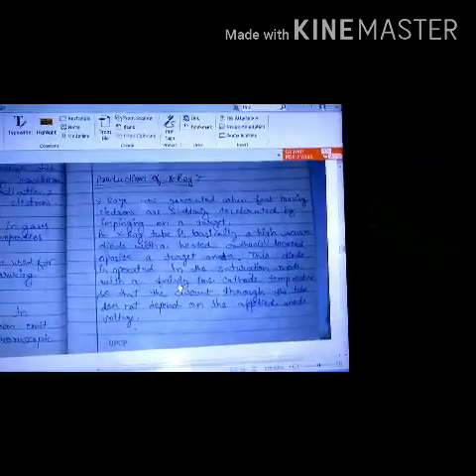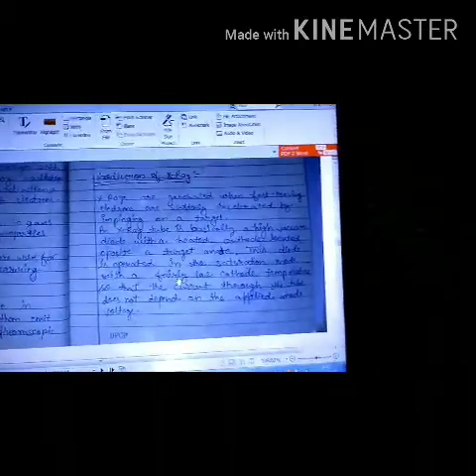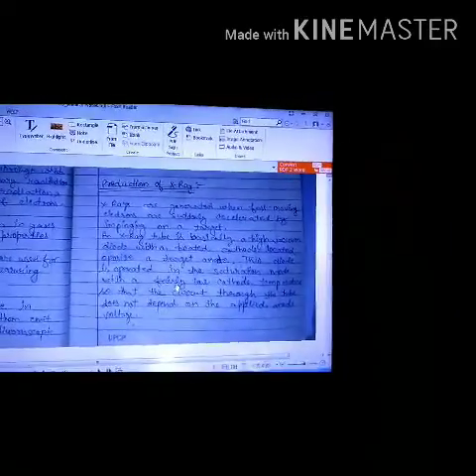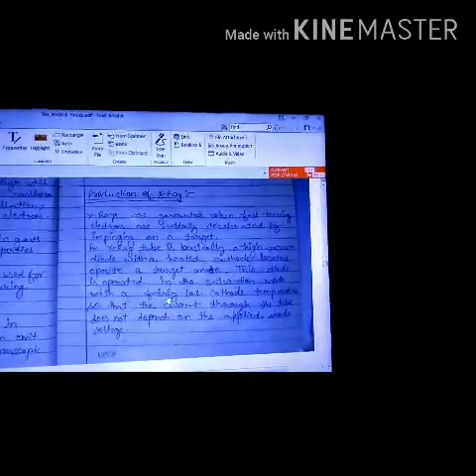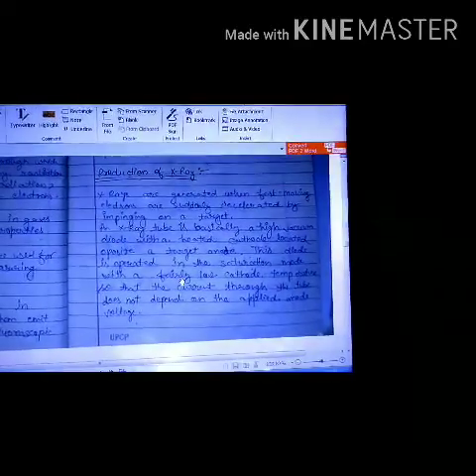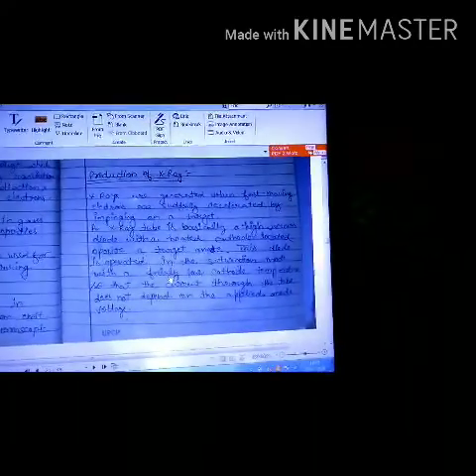In the present video, we are going to look at the production of X-ray and the X-ray machine. Production of X-rays is a topic related to how X-rays are normally produced in the machines and what procedure is usually required.